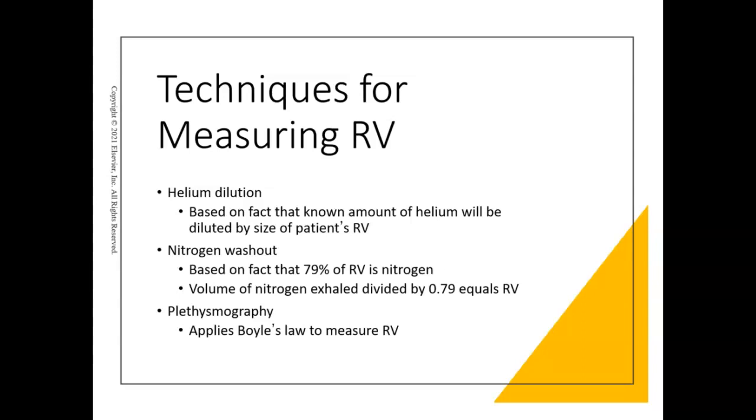Okay, so when we're interpreting lung volumes and capacities, so again, these are volumes. Any abnormalities with this are usually related to restrictive diseases. So if your TLC is decreased, so it's less than 80% of predicted, then that indicates a restrictive disease.